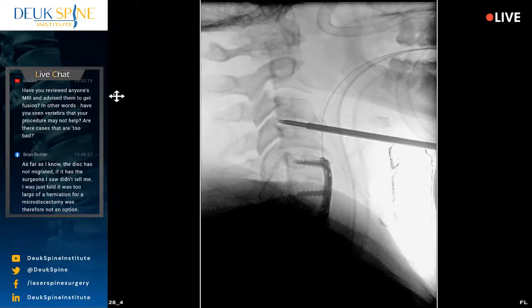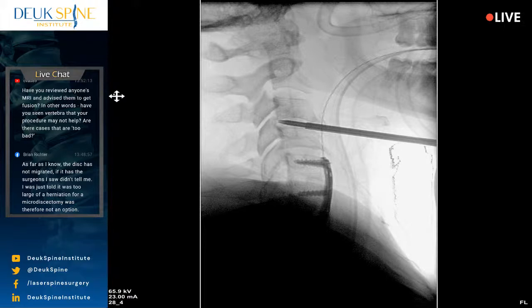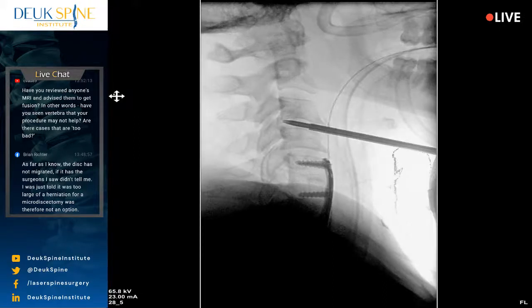Shot. Oh, it's painfully slow. Take that away. All right, so I need to advance this tube. And shot. And I'm not doing a very good job of it. So I need a dry, there we go. Now you're going to have to clean this out, okay?